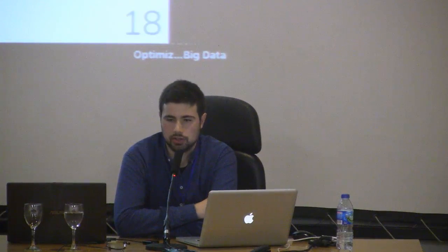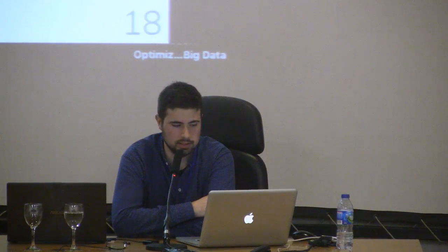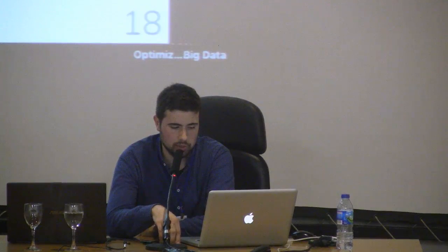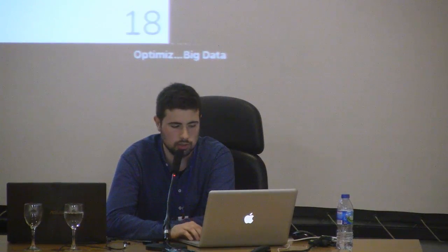Okay. So what we want is basically to predict the age of patients. To do so, we are going to give sessions with age. This means that you'll have access to a data set with 1,000 subjects. All of them will have a T1 MRI image, and all of them will have their age in years. We do it this way so that you can train any model that you want on this data, and then we will evaluate against some unseen data that you will not have access to.